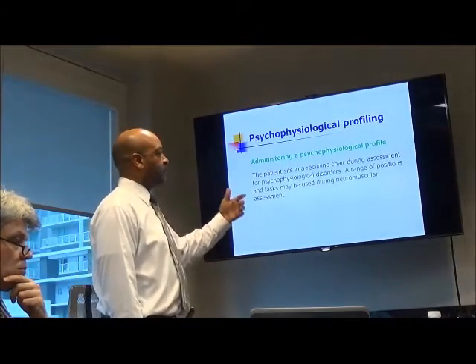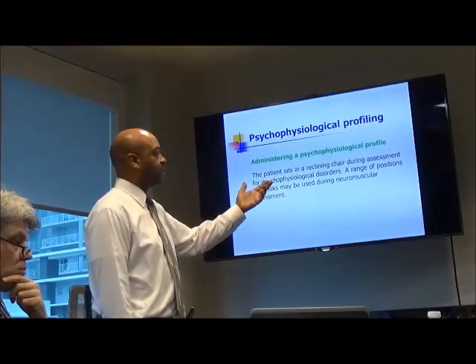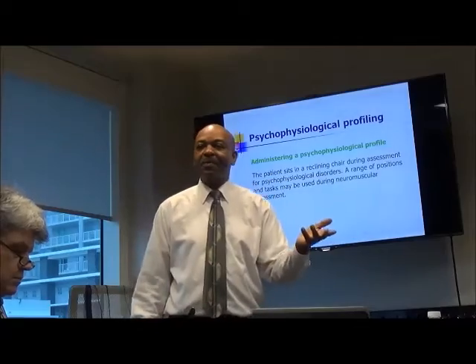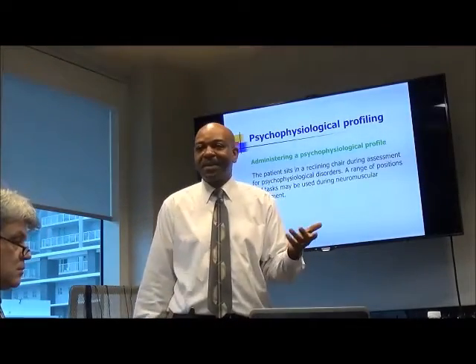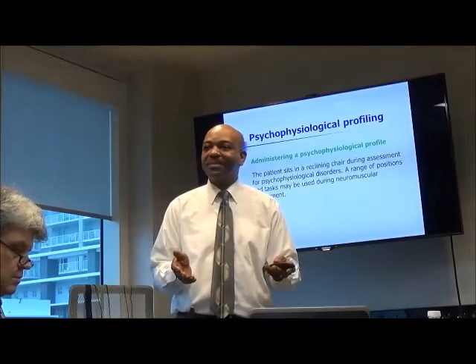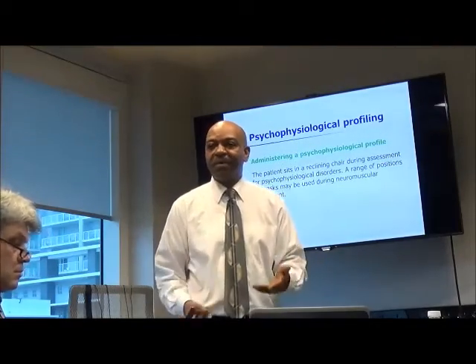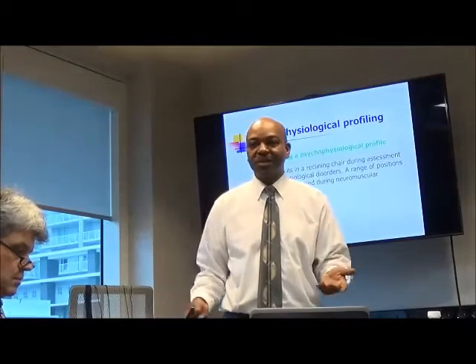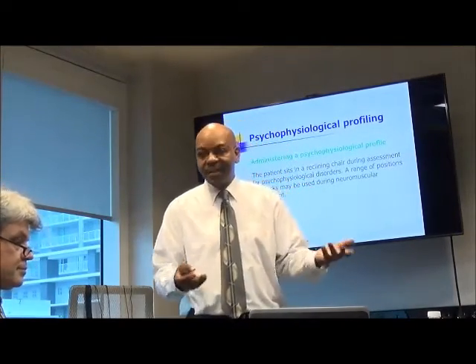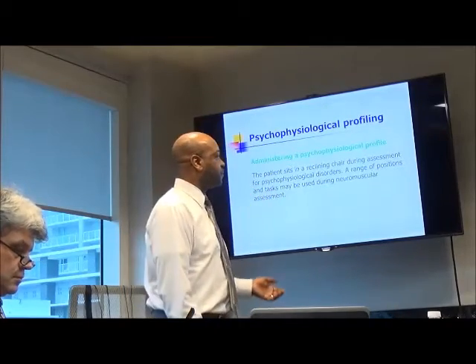Here they're talking about the process. The person sits in a reclining chair during assessment. I don't necessarily agree about the reclining chair, because I want it to be a more normal situation, like at work or play. Most people don't spend a lot of time sitting in a reclining chair. Now, if you're trying to encourage them to relax, a reclining chair can be helpful.